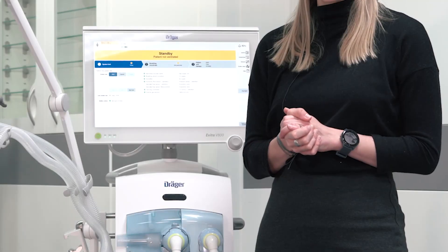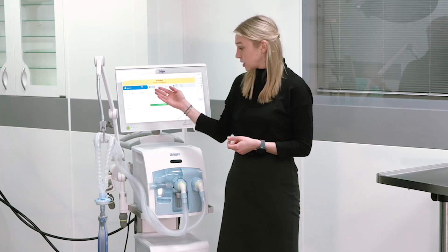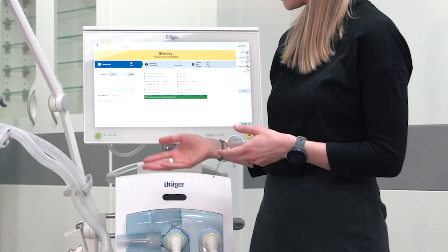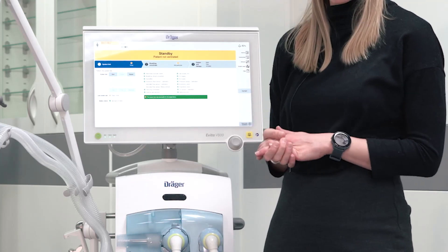Now the system check runs automatically. A successfully passed test step is marked in green, a failed test step is marked in red, and a skipped test step is marked in grey. If you want to repeat a certain test step, you can directly do that from here. If the system check is successfully passed, we can continue with the breathing circuit test.